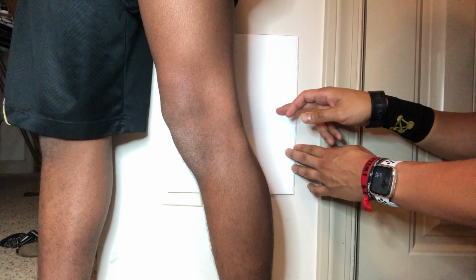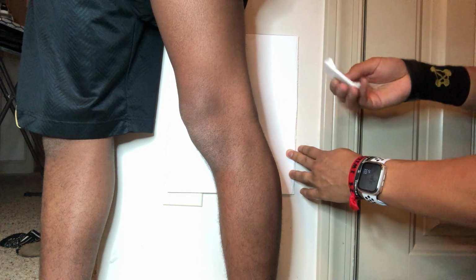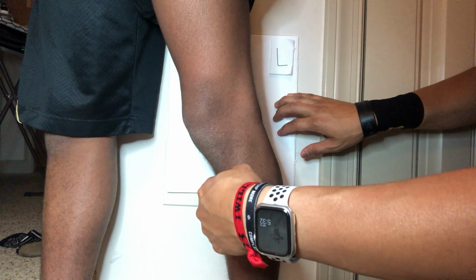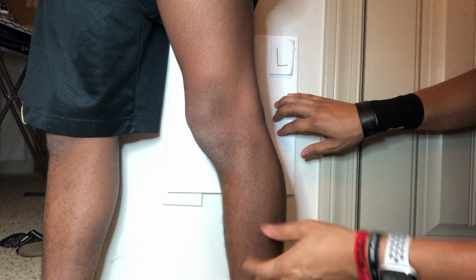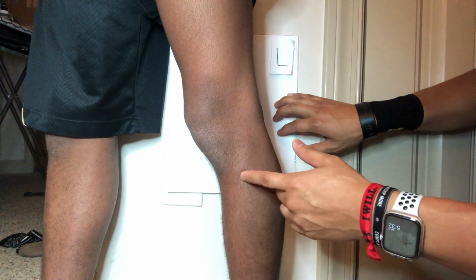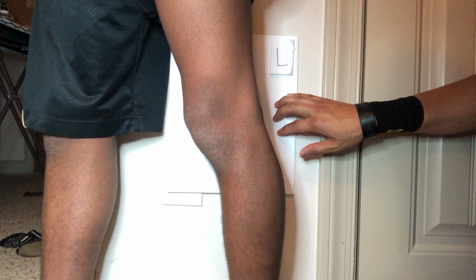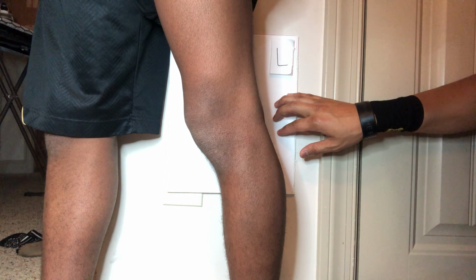Again, it's at 40 SID, 10 by 12 image receptor. This being the left leg, we're going to place the left marker. Central ray again is going to be ½ inch below the apex of the patella through the center of the film space. We're going to collimate so that we can include both the bone and soft structures of the knee, as well as the head and neck of the fibula, as well as the proximal tibiofibular joint. We're going to shield the patient as necessary for protection from radiation, and ask the patient not to breathe and not to move.